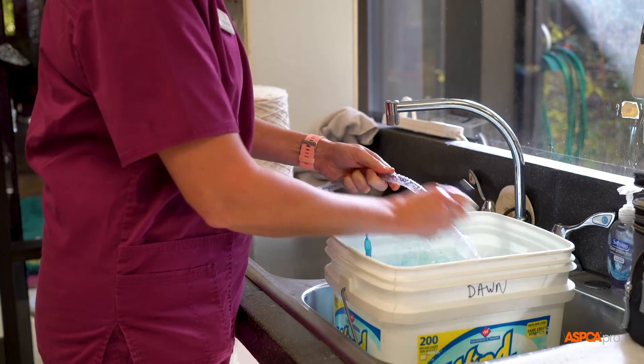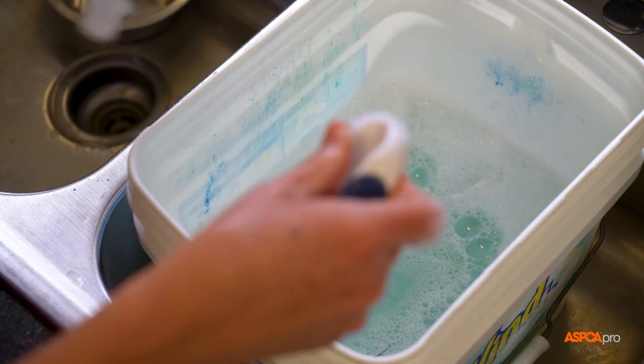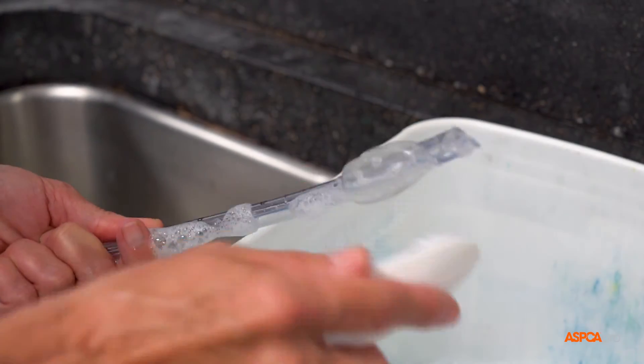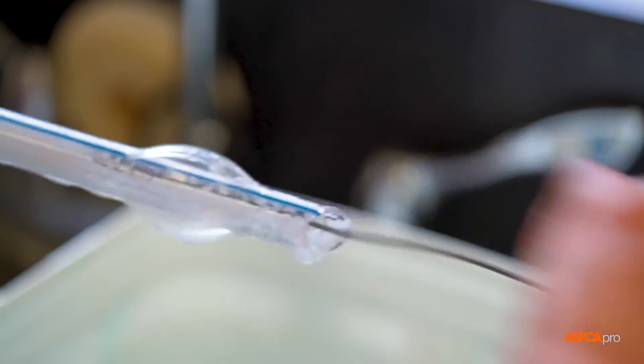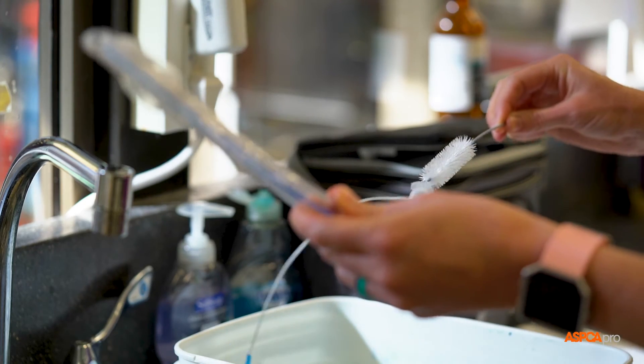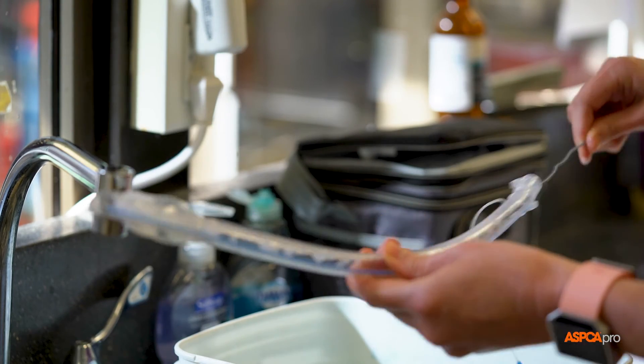Next, clean the outside of the tube with soapy water and ensure all mucus and debris is removed from the cuff and the hole near the end of the tube. Use a long tube brush with soapy water to clean the inside of the tube, inserting into both ends to ensure the entire tube has been cleaned thoroughly.